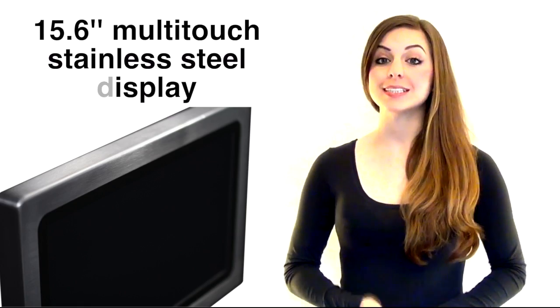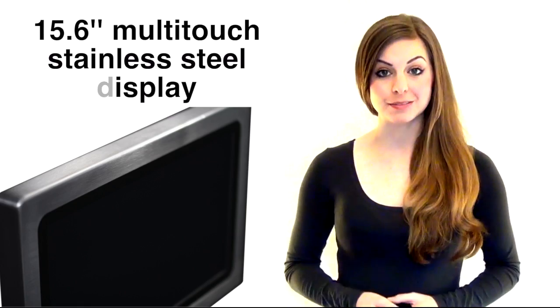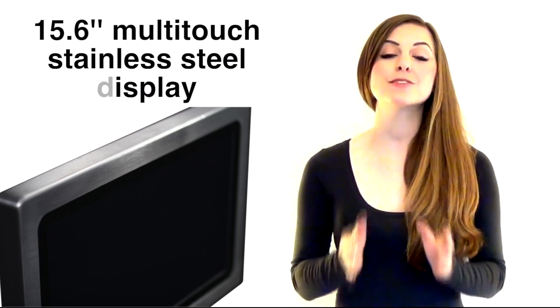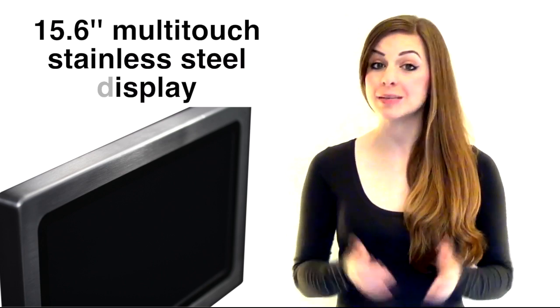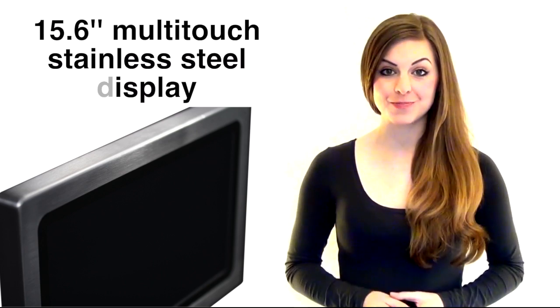The 15.6 inch multi-touch display allows for intuitive, simple operation.